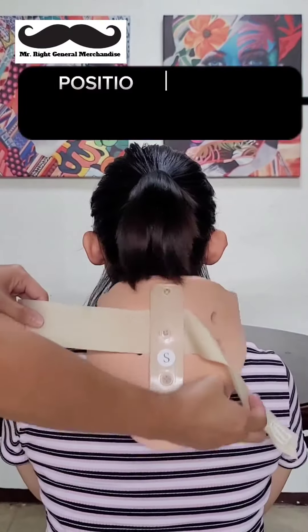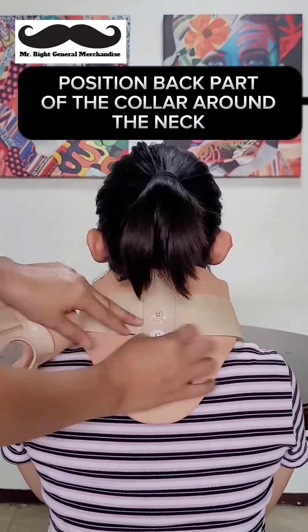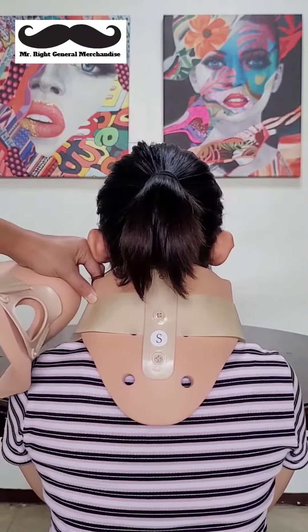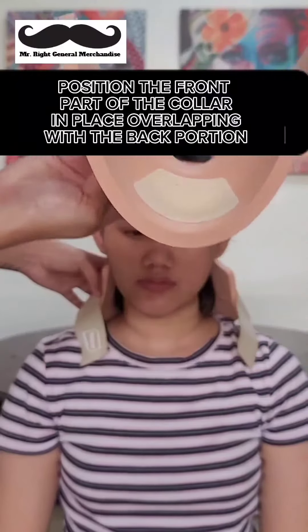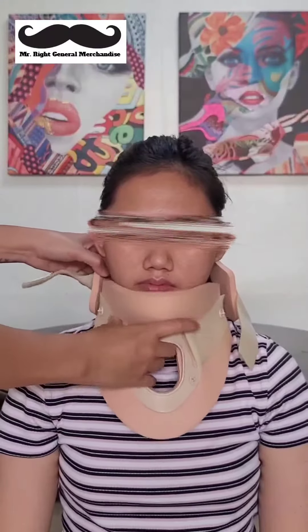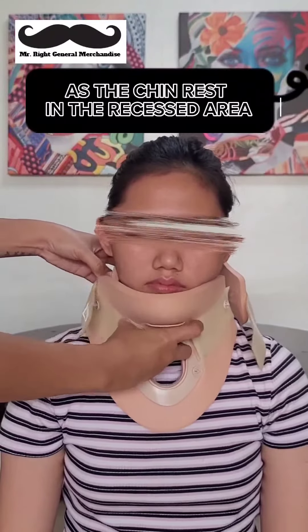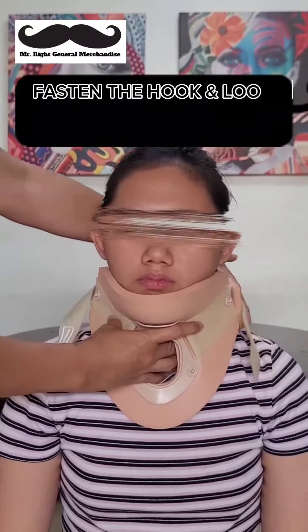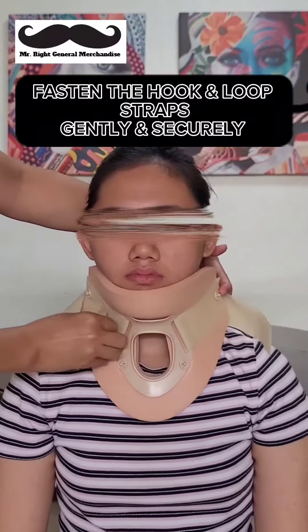Position the back part of the collar around the neck. Position the front part of the collar in place, overlapping with the back portion, as the chin rests in the recessed area. Fasten the hook and loop straps gently and securely.